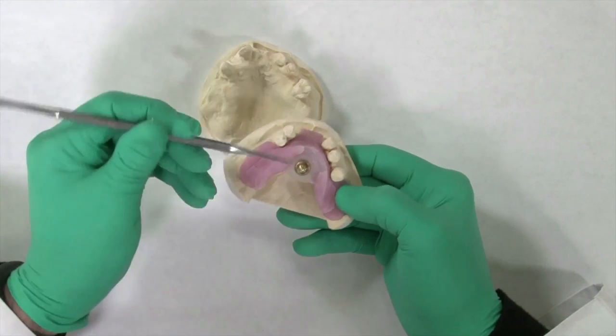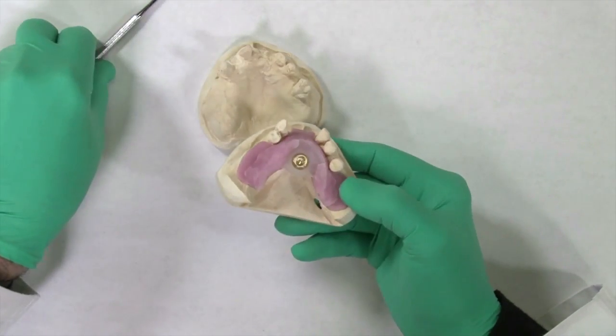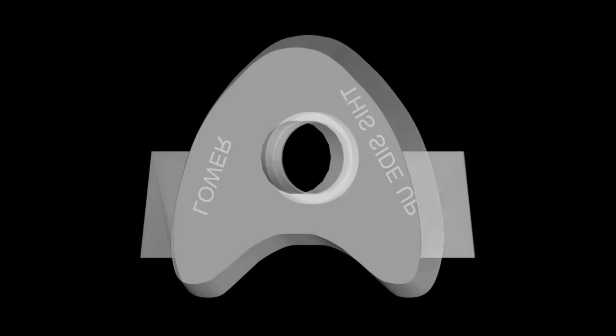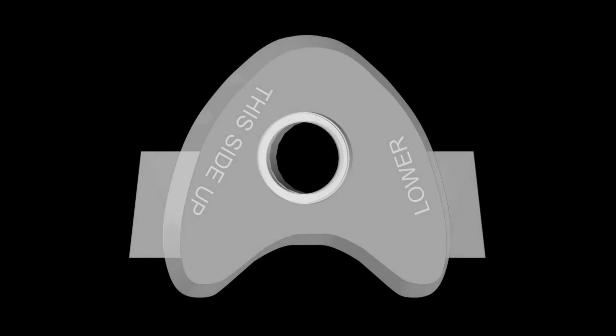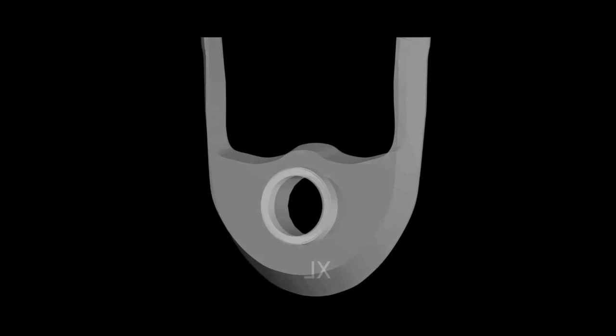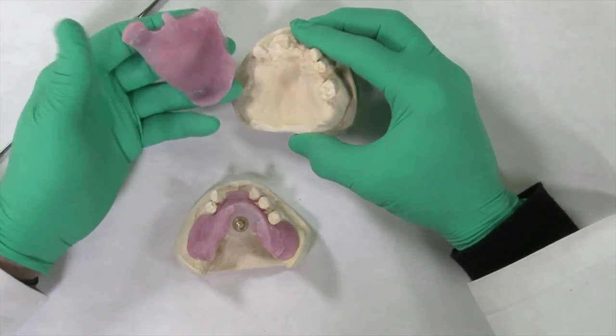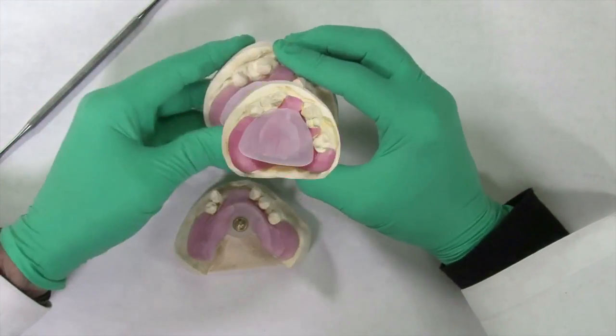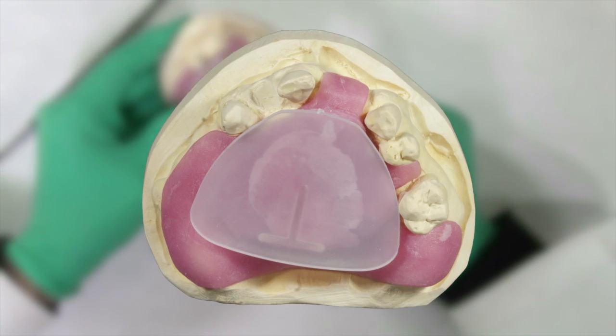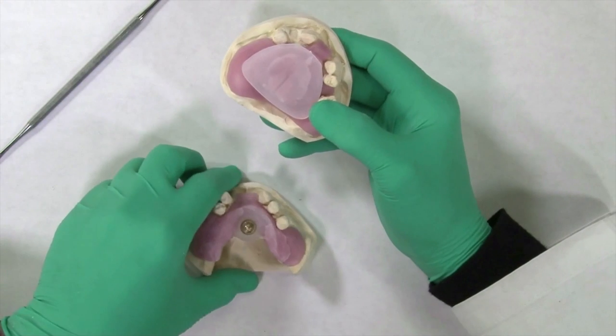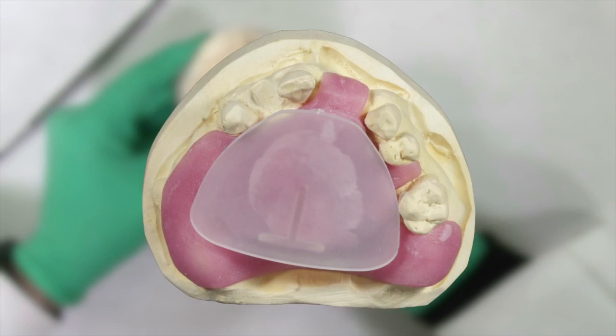In a dentate or partially dentate case, it is necessary to utilize either the small pin receiver or one of the modified pin receivers to avoid the teeth when mounting. Similarly, on the upper arch, a base plate is fabricated with tissue stops in the edentulous areas and palate. A striking plate is then attached, once again staying below the occlusal plane. The striking plate can be easily trimmed with an acrylic burr to avoid impinging upon the teeth.